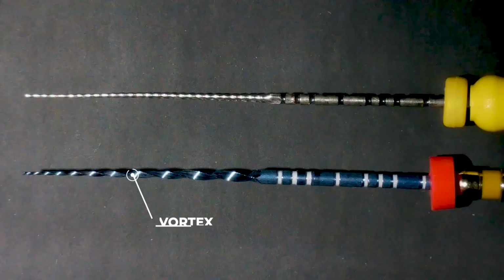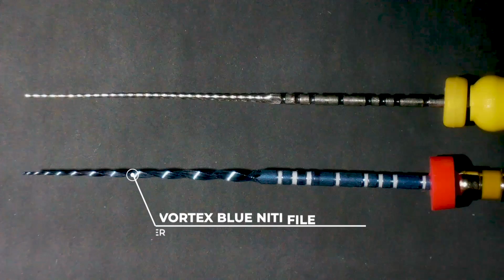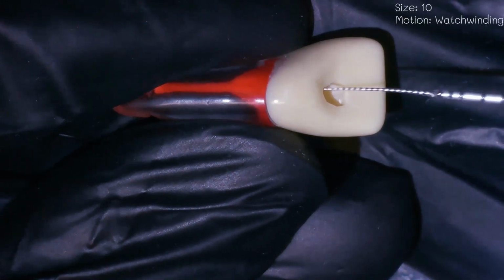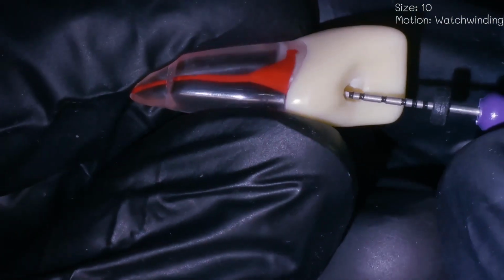However, Vortex Blue Nickel titanium files are extremely flexible and strong, which helps keep the file centralized while effectively cleaning and shaping curved canals. For this reason, pre-curving hand files number 10 and 15 facilitates negotiating the canal while maintaining its original anatomy. Patency is establishing and maintaining a clear path from the canal orifice to the apex of the root. This is done by using number 10K file, and in severely curved canals, using number 8K file.